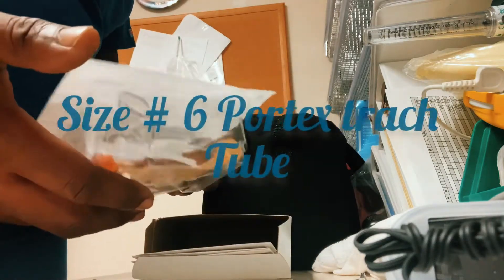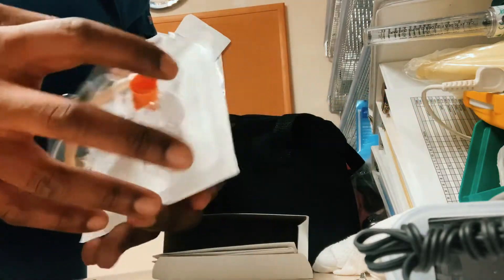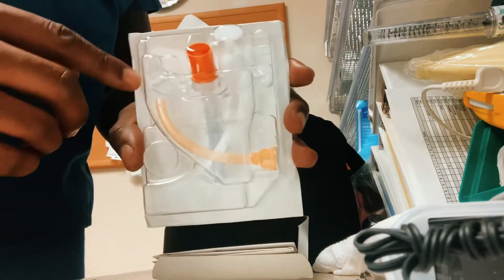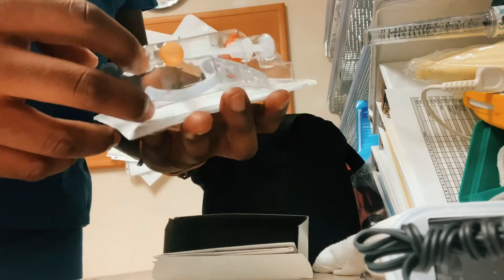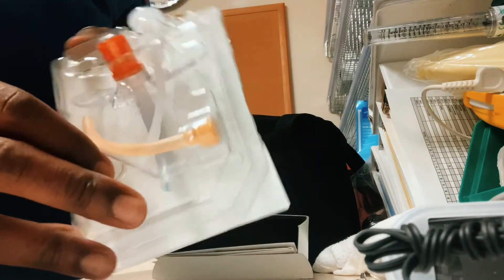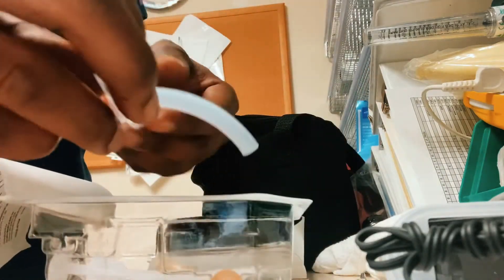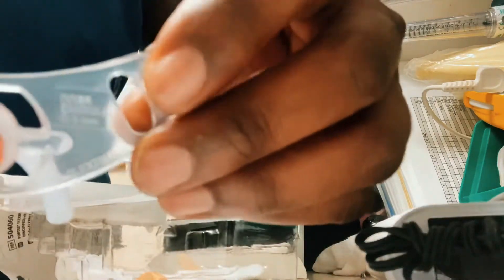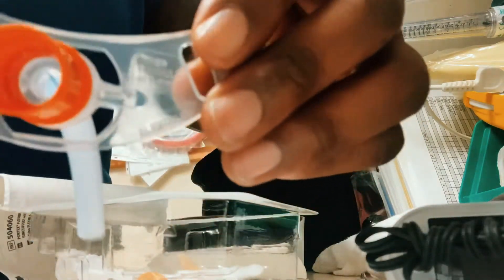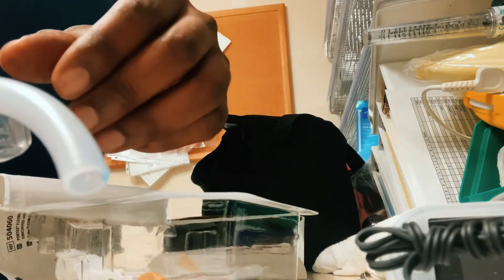In the respiratory world, this is our size six Vortex tracheostomy tube. As you can see, the flange is clear. It's non-cuffed — we don't see any pilot balloon hanging from it. This is the flange of the trach, and this is where the trach ties go into the actual trach.